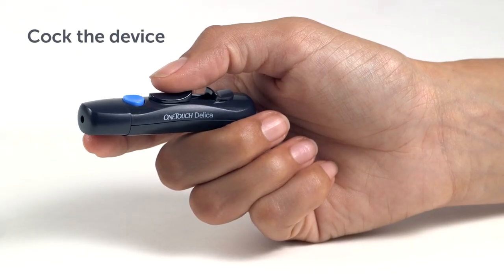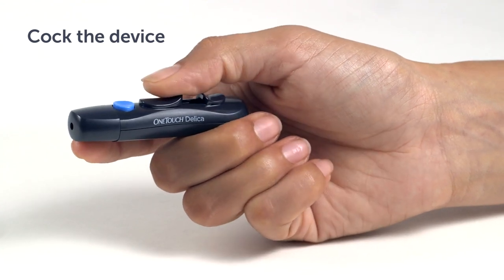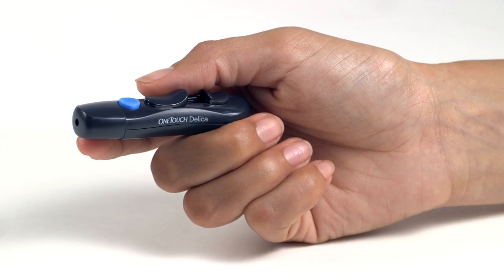Now if you have followed the instructions in your owner's booklet for preparing a blood glucose test, check that the OneTouch Delica lancing device is armed. Slide the cocking control back until it clicks. If it does not click, it may already have been cocked when you inserted the lancet.